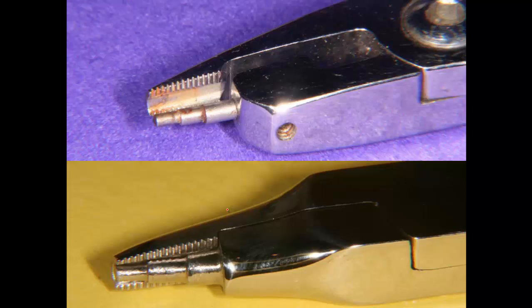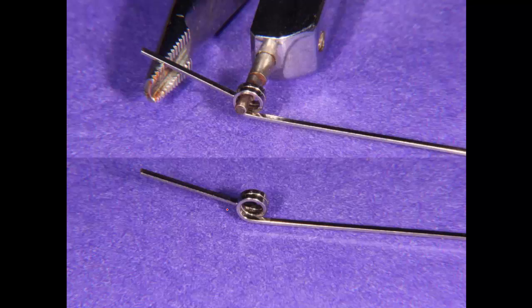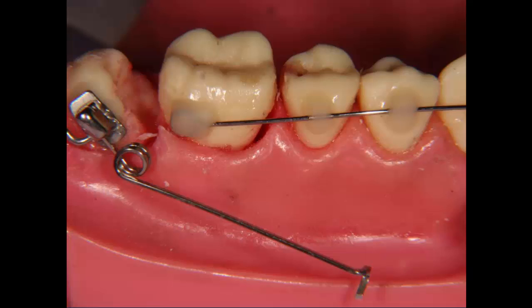Now there they are, different views of the pliers. Here we are bending this loop, and actually we bend it off of this. You put it up in there and tighten it up, and then you bend it more or less with your finger as you put pressure on the little loop. Put it in the mouth and it works great.